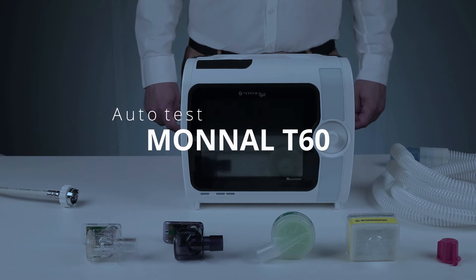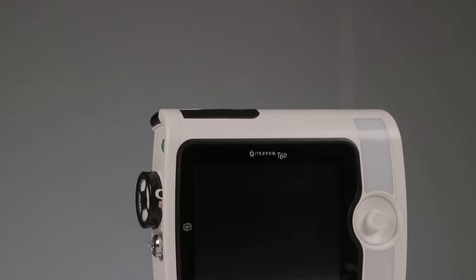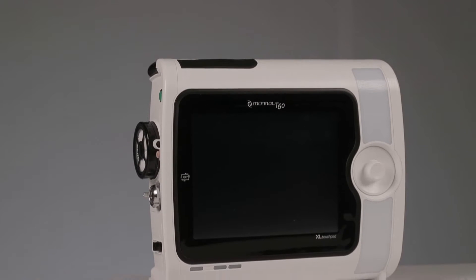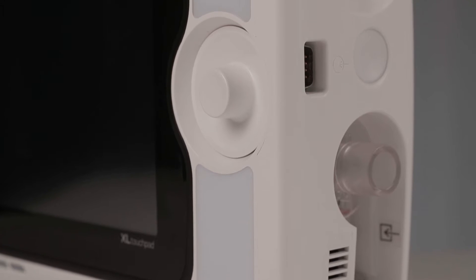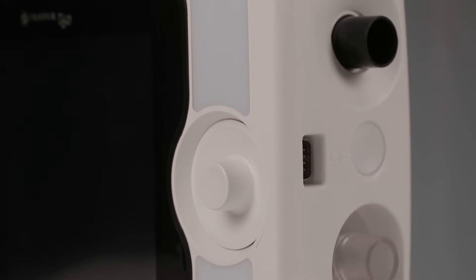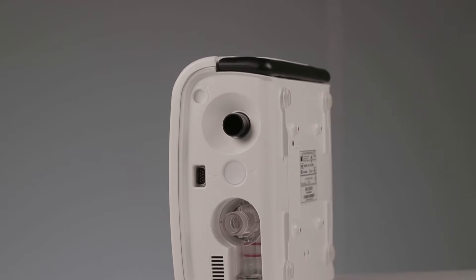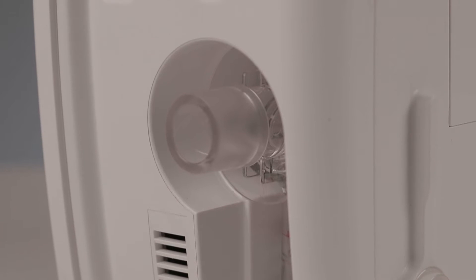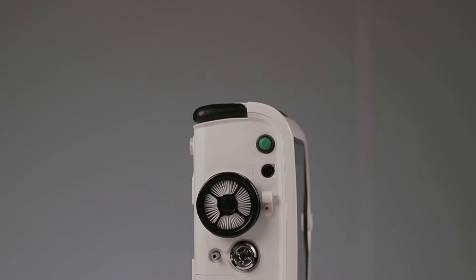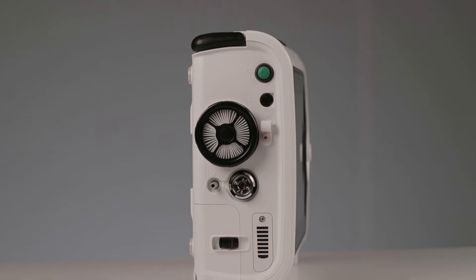Hello and welcome to this video presentation of the Monal T60 ventilator from Alikid Medical Systems. The purpose of this video is to learn how to do the autotests. The autotests verify the integrity and proper functioning of the internal components of the device. In particular, they can be used to calibrate various sensors such as the expiratory flow sensor and the oxygen cell. Without these tests, the accuracy of the ventilation parameters and measurements cannot be guaranteed.